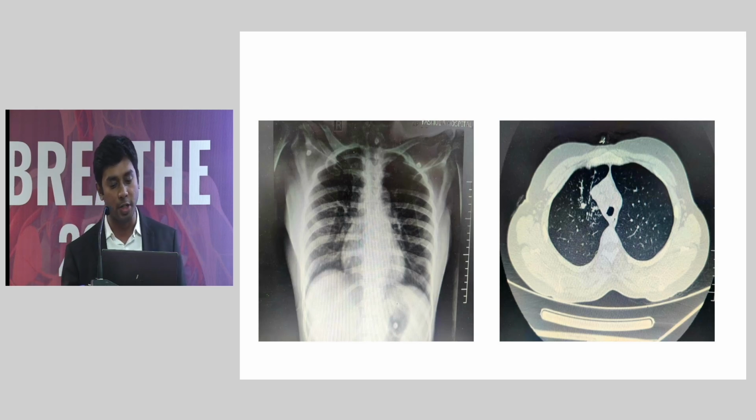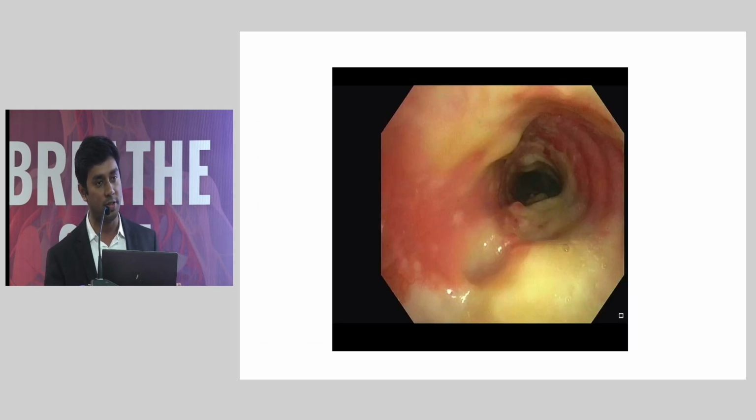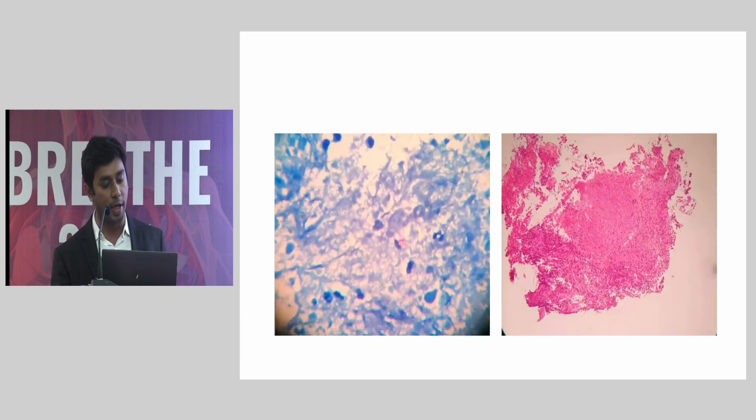So we took up this patient for a bronchoscopy and what you are seeing is nothing but an actively caseating endobronchial TB. If you had not done a bronchoscopy for this patient and had treated with only ATT, the possibility of developing into a later stage of stenosis is quite high. So we took a biopsy and a BAL to confirm the presence of endobronchial TB. As you can see from here, there is presence of AFB along with the granulomatous inflammation. And we started this patient on ATT and steroids.